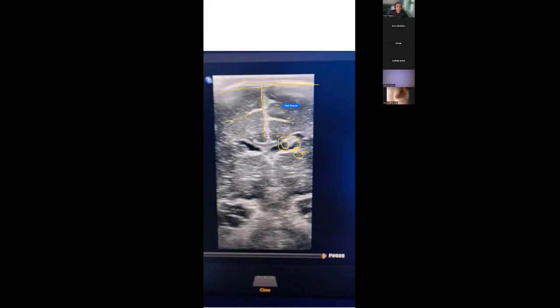So very nice scan. I found linear is okay, but the problem is if the baby is term or has a small fontanelle, it's a little bit difficult to see everything. You'll have to take multiple views. Hence, what I'd say is that really the backup should be using your curvilinear probe. And then if you want to look at the meninges or you want a clearer image of the more superficial regions with a higher frequency, you can use the linear.